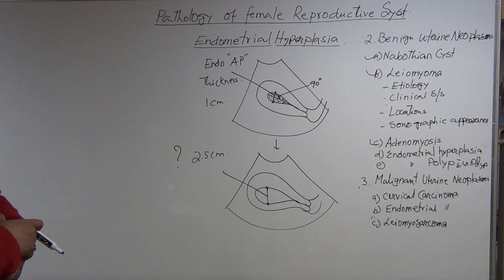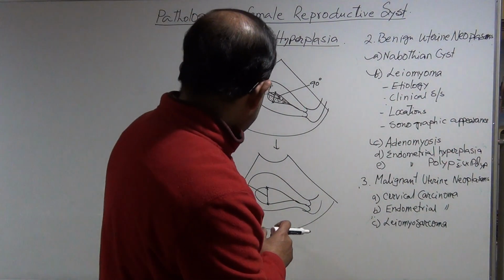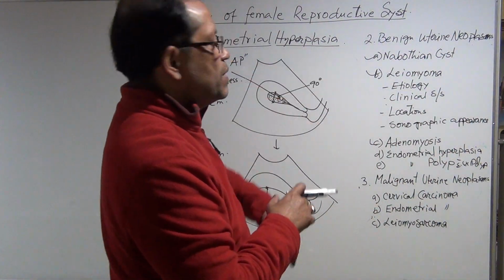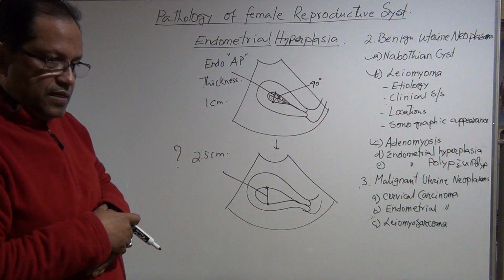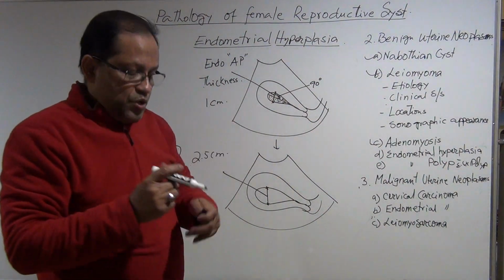Okay, it's very big. Then we consider it as endometrial hyperplasia. So now understand that. What does the endometrium do?